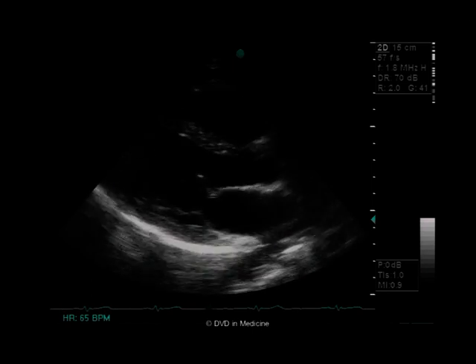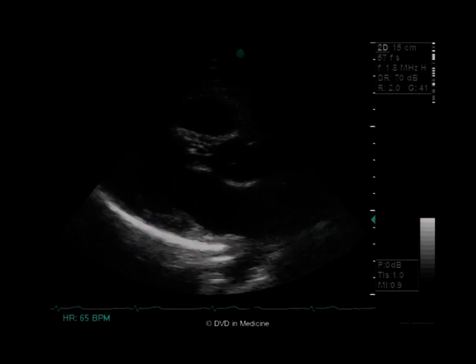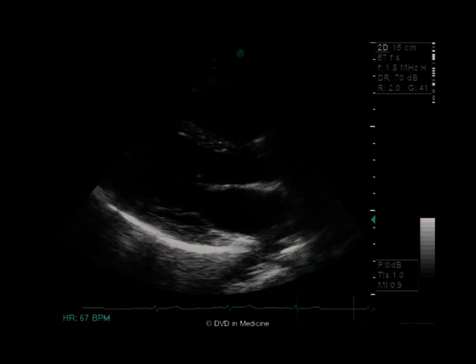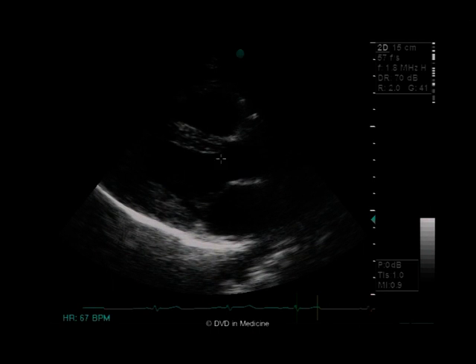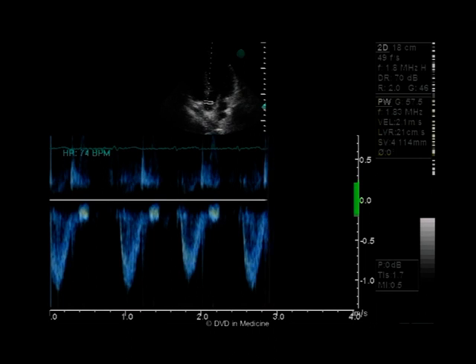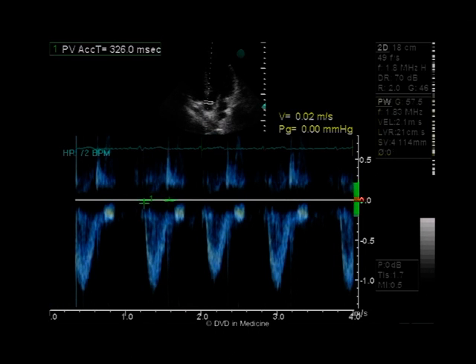In this image, one can see the calculation of the left ventricular ejection fraction using the Doppler method. Using the Cineloop function, one measures the left ventricular end diastolic diameter. This parameter is 4.9 centimeters. By using the Cineloop function again, one measures the outflow tract diameter at the base of the aortic leaflets. One obtains a 5-chamber view and places the pulsed Doppler sample volume at the level of aortic leaflets. The pulsed Doppler velocity integral is obtained. One measures systolic flow duration, which is 32 hundredths of a second, and its maximal velocity, which is 1.2 meters per second.